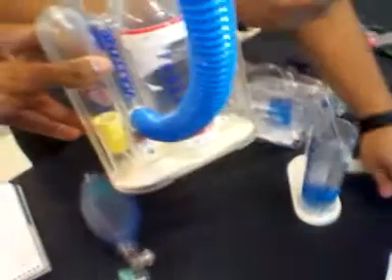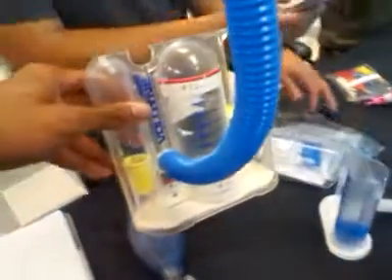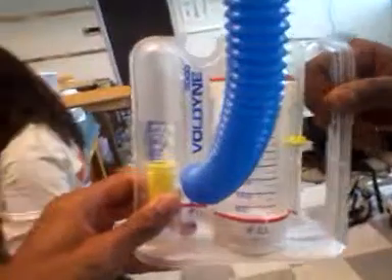What's this? Hey Vince, what's this? I don't know, I forgot what it is. What's that? Incentive spirometer. Incentive spirometer. Take that out of your fingers.